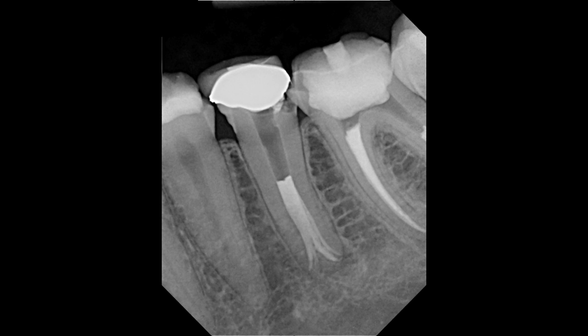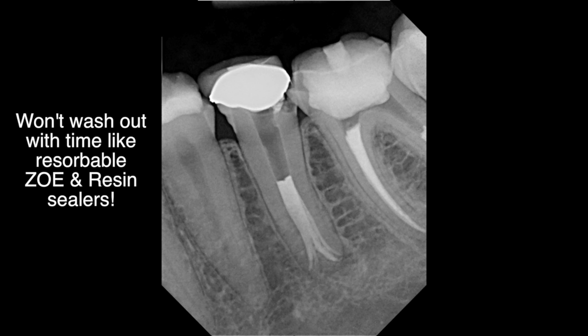BC Sealer is a filler, and therefore any area where you have potentially filled only with cement remains filled with cement. As you saw in this case, the MacPak is an option for placement of the BC Sealer. However, it is very easy to understand that a lentulo spiral or even a MacPak is not recommended at higher RPMs. For the basic obturation technique using BC Sealer, I still recommend placement of the sealer in the canal using your master apical file or a hand file, versus using a high-speed rotary instrument such as a MacPak or lentulo spiral. This is especially true whenever you are near a vital structure such as the inferior alveolar nerve, the mental foramen, or the maxillary sinus.